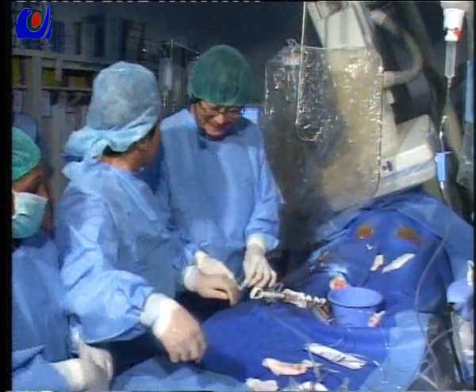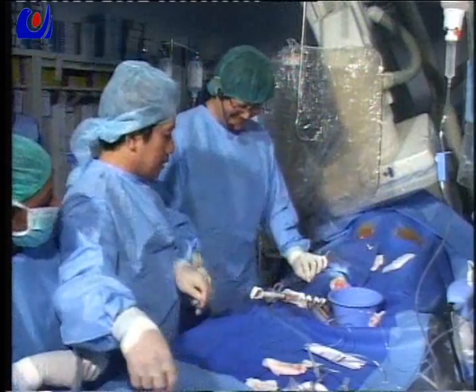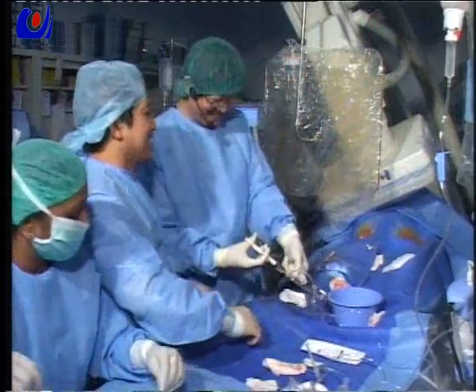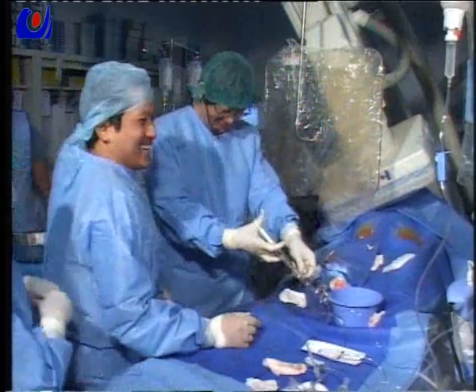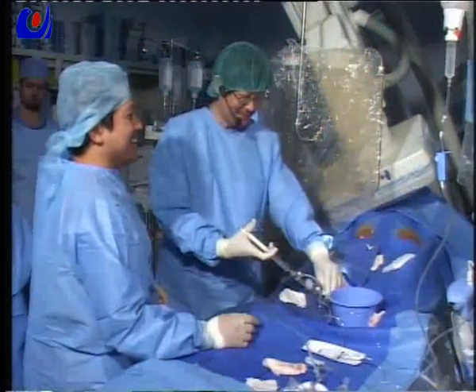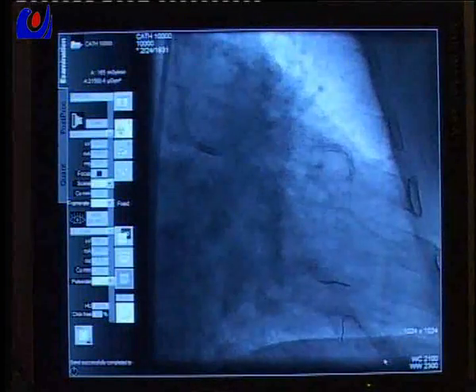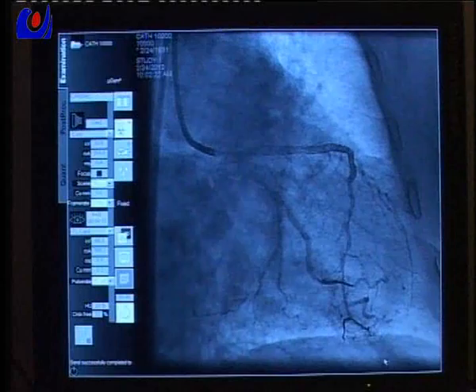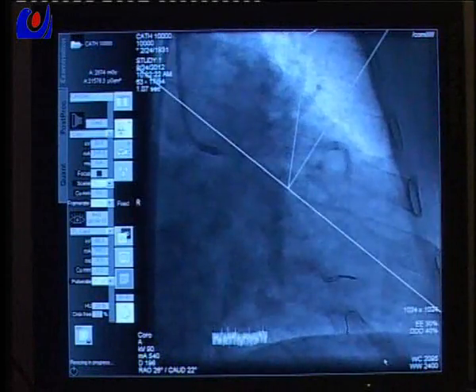We'll check to see the circ. No, you check with the circ. Should be no problem. Usually, with this amount of plaque, we are not plaque shifting too much. Yeah, we have some narrowing. So go back to the original spider view, and we can do rewiring.